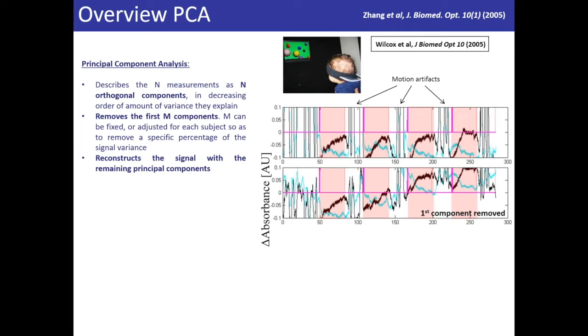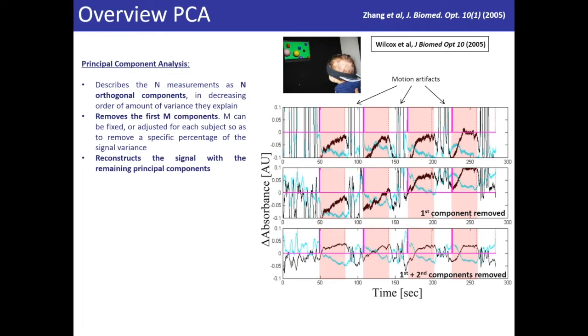Here a PCA filtering is applied to the signal. Only the first principal component is removed, and you can see the reduction in motion artifacts, but it's still there. So it's not as large as this here, but it's still there. And here, the first two principal components are removed, and the artifacts are much more reduced. Here, if you look at this blue line versus this and this, we have a much reduced motion artifact.